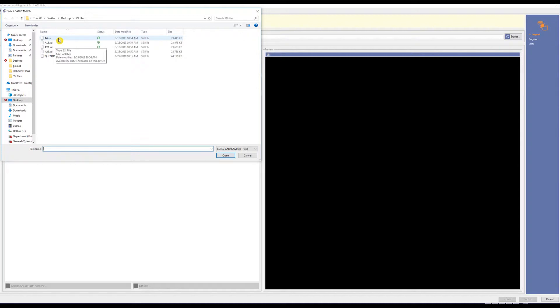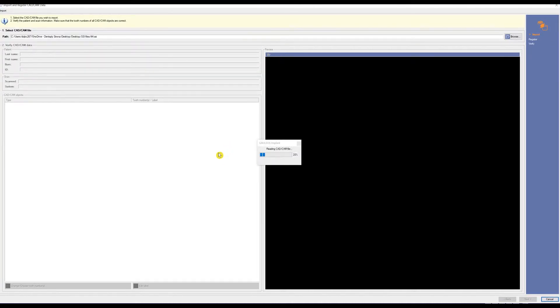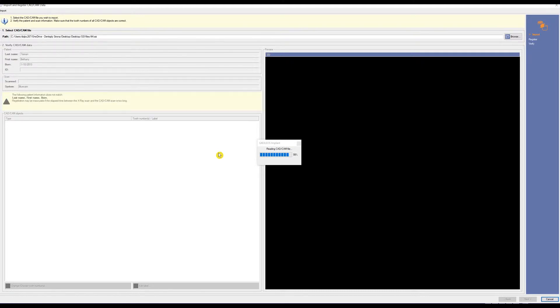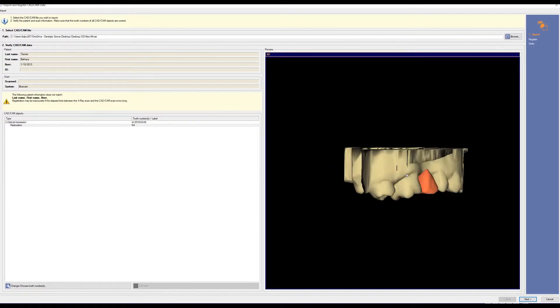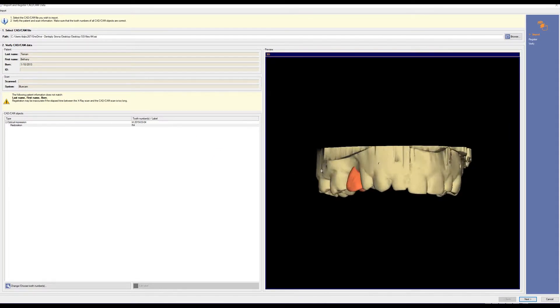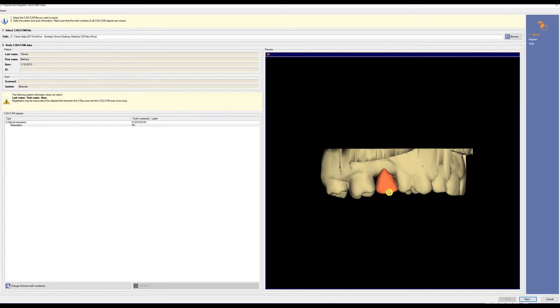Let's pull in tooth number four. Once the software has read the file, this should look familiar to CEREC users. We have our SSI optical impression as well as our design crown. Click Next at the bottom right-hand corner.